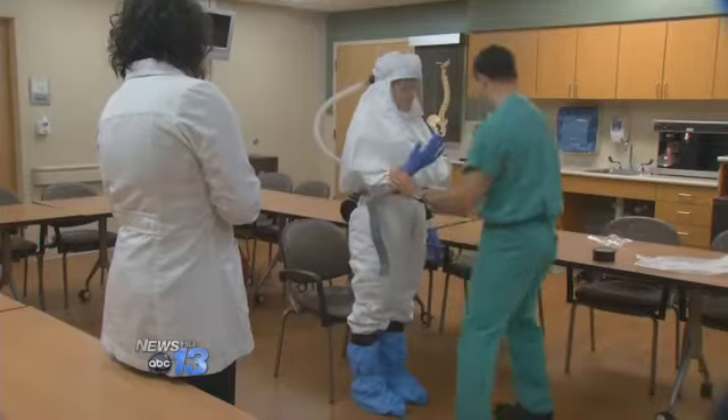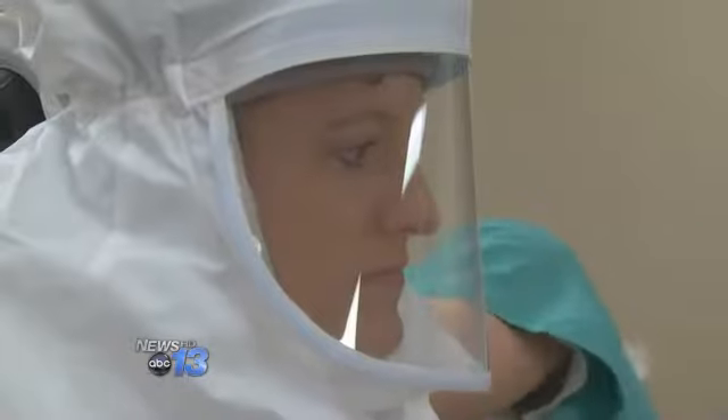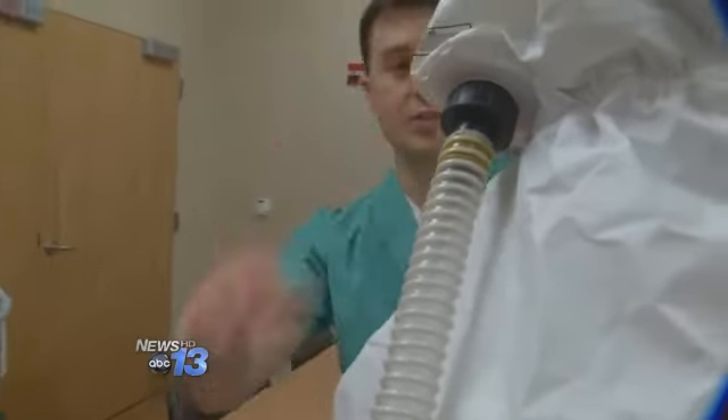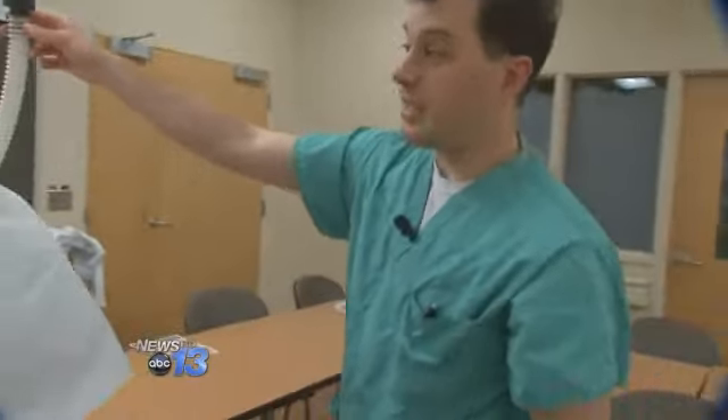Taking the gear off, or doffing, is a time when Ebola exposure can happen. Normally the person assisting would also have gear on, but Dr. DiRienzo is without the suit so he can talk us through the process. He says first the care provider's suit would be wiped down, and then J.C. can remove her hood.